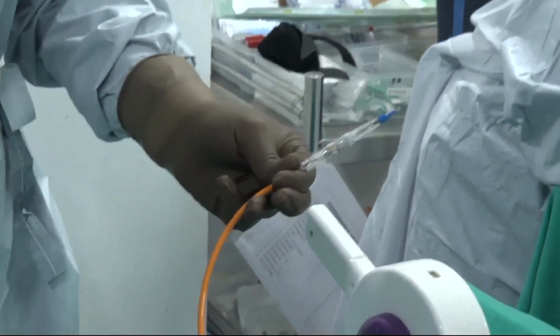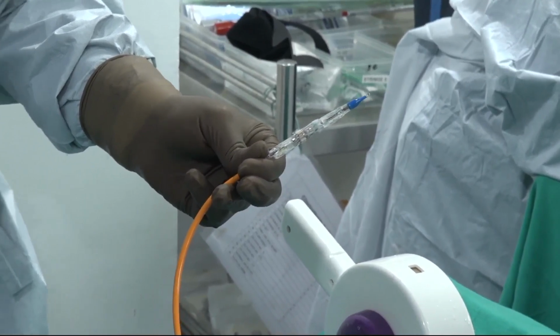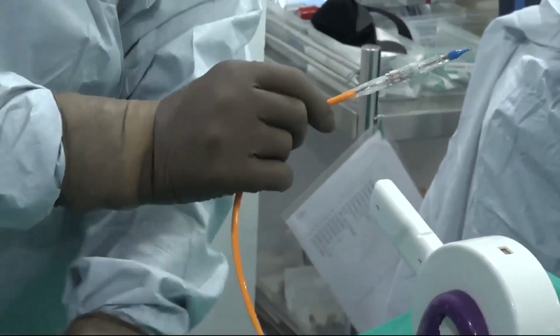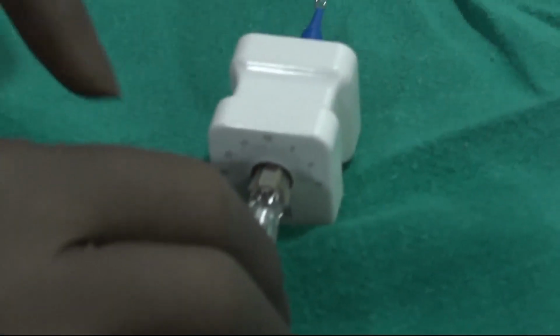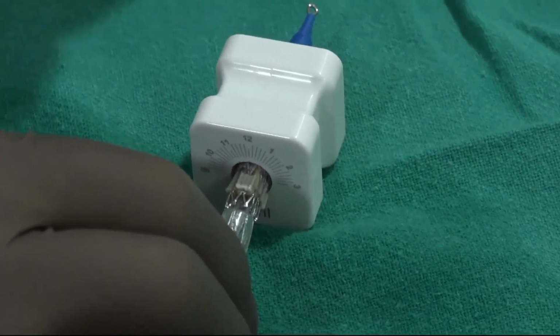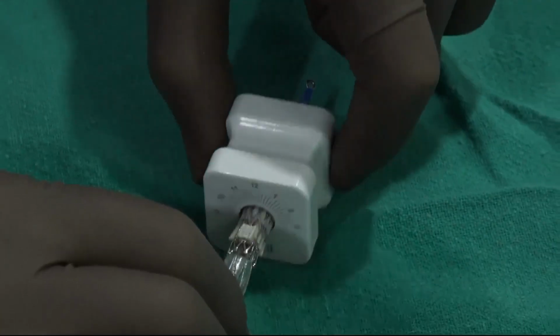After the crimping, we have not changed the angle of the commissure. We get the small dial to cross check again before we finally crimp. So if you see, this white post is again the commissure post, and exactly it is at 12. So we are good to go for final crimping.